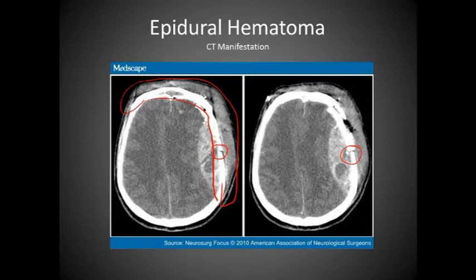So quite severe skull fracture there, and as we can see, we have the hematoma here. It's questionable as to whether this is acute or subacute based on the level of hyperdensity that we're seeing. We're not seeing it being as bright white as the skull, but we do see still some hyperdense areas.